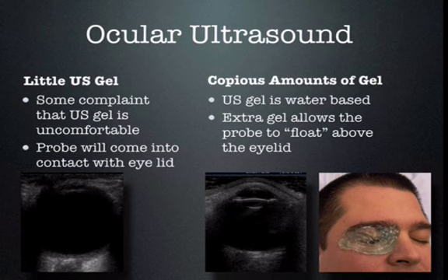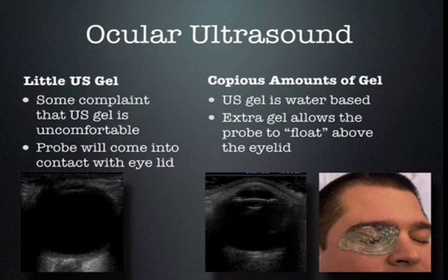If you use very little gel, your probe is going to be coming in contact with the eye, and you may be transferring pressure from your probe to the globe. If you have an open globe or a potential open globe, you would not want to do this. In that case, you would want to use a lot of gel. When you use a lot of gel, you can see a black stripe above the eyelid, and you know that you're not touching the eye at all — therefore, not causing any extra pressure inside the globe or causing vitreous to extrude out of a potential hole.